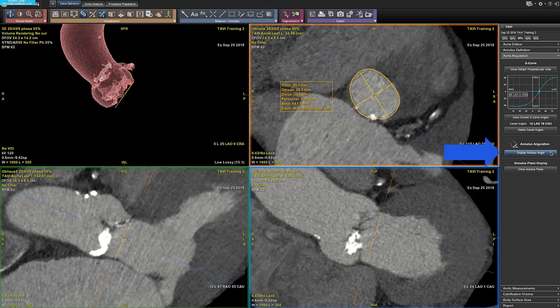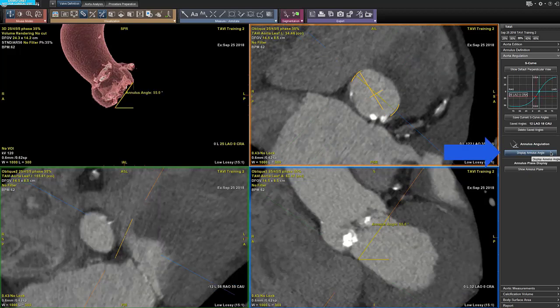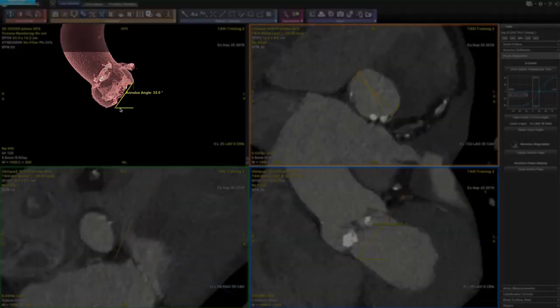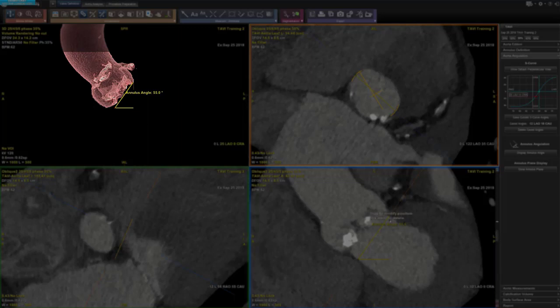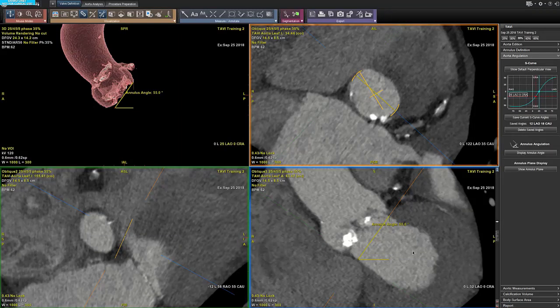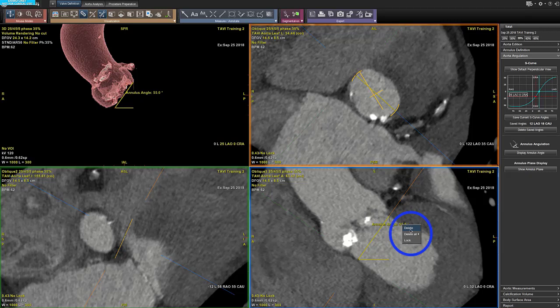Click on Display Annulus Angle and the angle between the annulus plane and the horizontal plane is displayed. This angle is intended to show how horizontal the annulus is. This measurement cannot be edited; it can only be deleted by selecting the measurement and clicking on Delete.